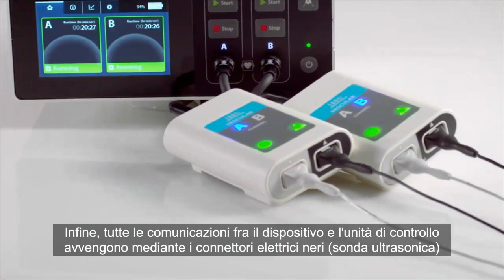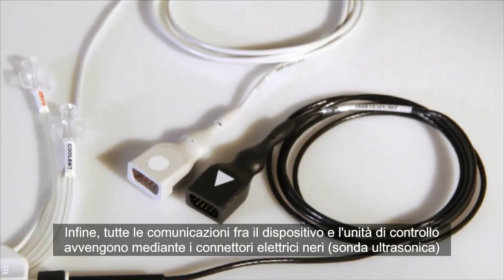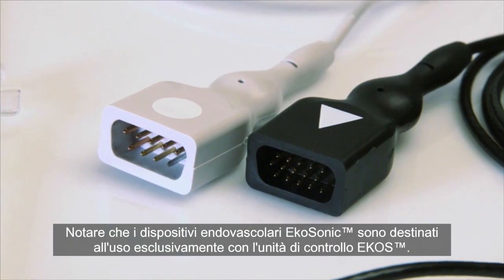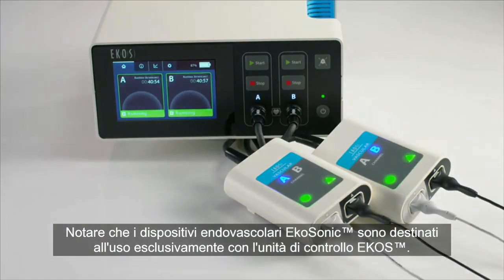Lastly, all communication between the device and the control unit happens via the black, ultrasonic core, and gray, infusion catheter, electrical connectors. As a final note, the EKOSonic endovascular devices are only for use with the EKOS control unit.